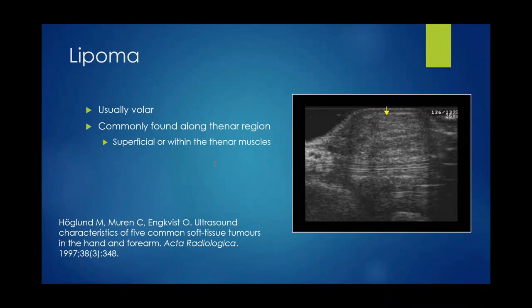Next question: what's your ultrasound injection technique for scapholunate OA? Transducer plane, needle size, gauge, etc. So that was one of my first couple of slides where I was talking about the dorsal recess. Typically, I would approach either the radiocarpal joint or the midcarpal joint in plane with the transducer and along the long axis of the hand.